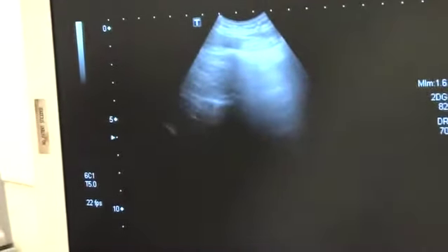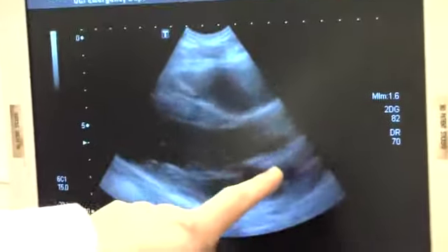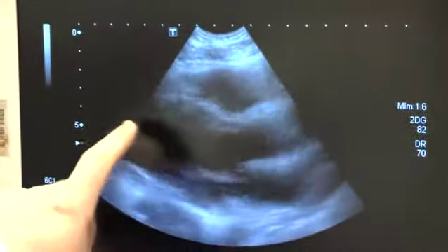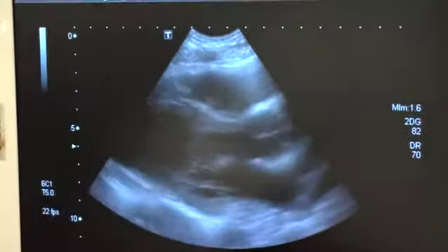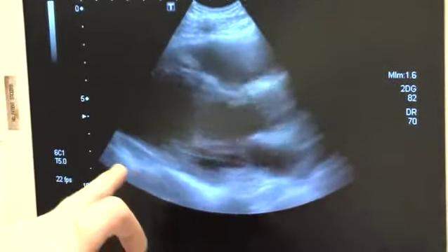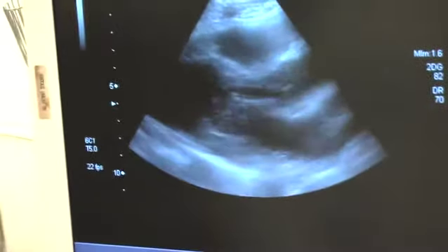By the way, just for teaching purposes, here's the anatomy, just to give you guys a refresher. This is the left atrium of the heart, the left ventricle. This is the mitral valve. This is the aortic outflow tract, and this is the right ventricle. What we're looking for is fluid around the heart, which I see none of, and global contractility of the heart, which looks appropriate.